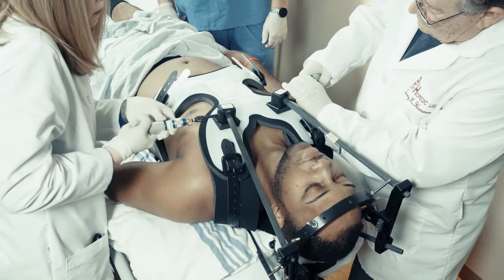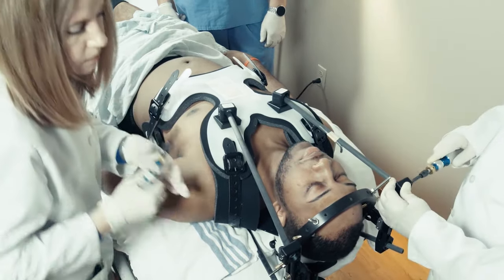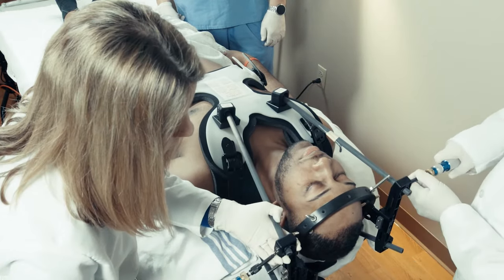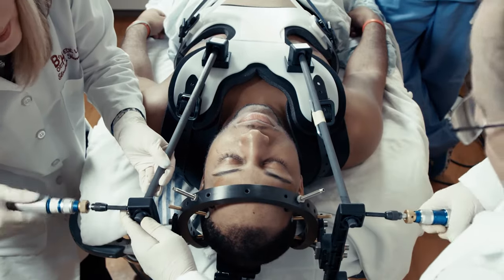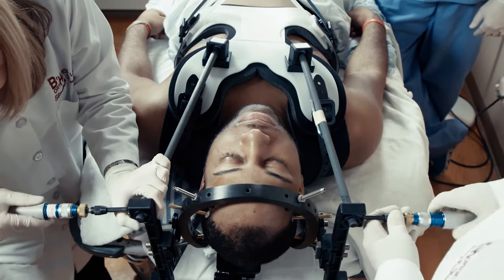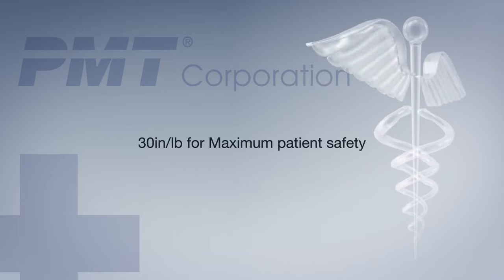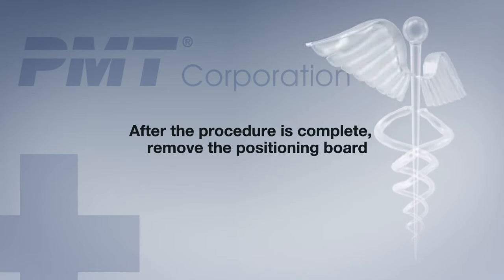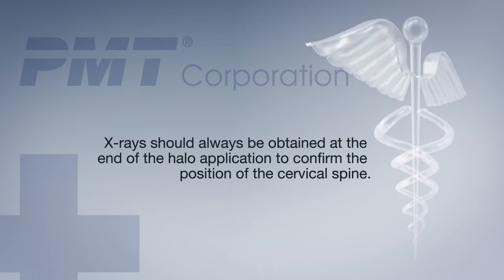With all the nylon balls loose, the degree of flexion and extension, rotation and translation of the cervical spine may be adjusted. Following adjusting, dictated by the nature of the patient's injury, all superstructure attachment points are tightened with the torque wrenches. The larger bit is placed in the wrench and set to 30 inches per pound. Research has shown that this torque setting yields the maximum degree of patient safety. Once the procedure is complete, carefully remove the positioning board. X-rays should always be obtained at the end of halo application to confirm the position of the cervical spine.